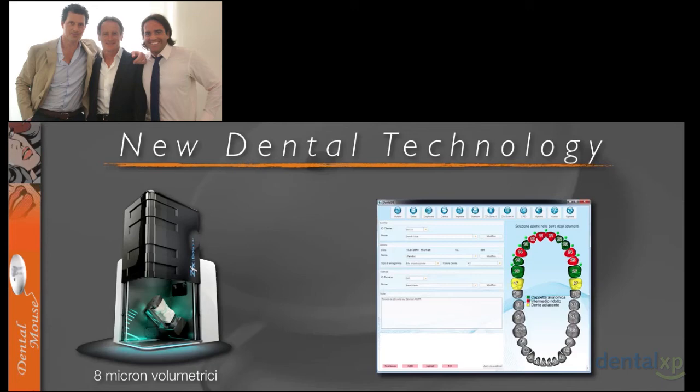Right now we have last-generation scanners, as you can see here. It's written that they have a precision of 8 microns of volume. That means it's not a precision of 8 microns on a single element, but 8 microns on a complete arch. So you can scan a full arch with a discrepancy of only 8 microns.